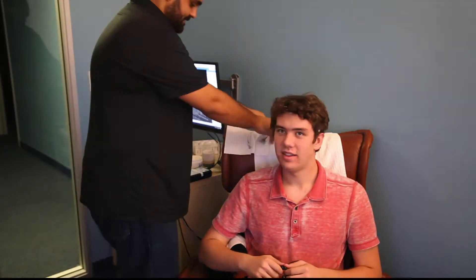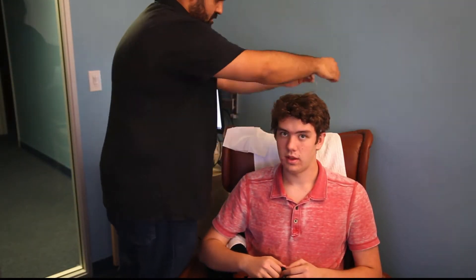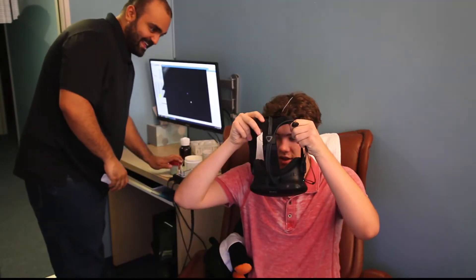This is virtual reality. You guys have seen these virtual reality headsets — we're using these with neurofeedback. Here as we begin, I've got Sam, one of our clinicians, an occupational therapist, and he's putting on the electrodes.